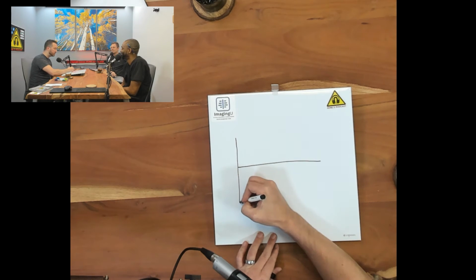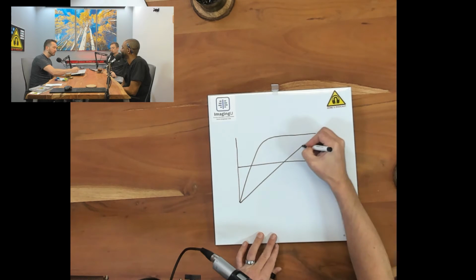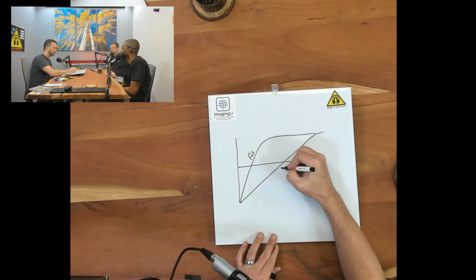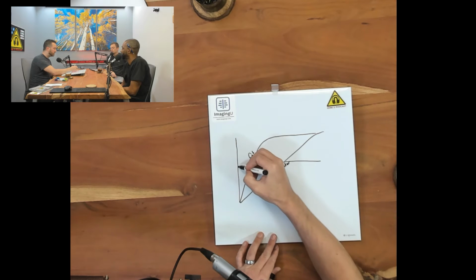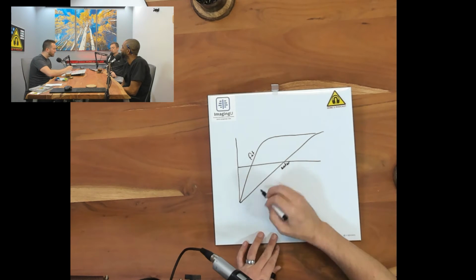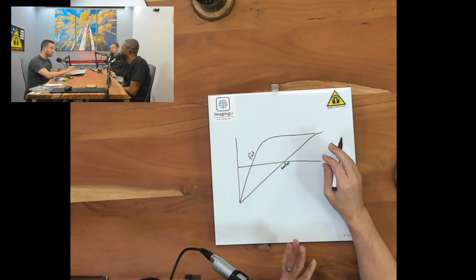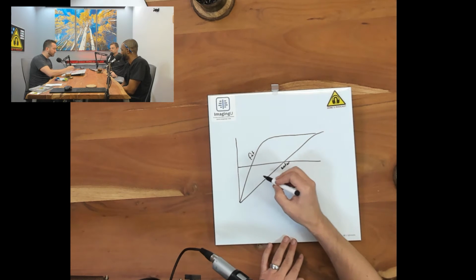So you see these T1 recovery curves. Let's say that's fat, and this is water. I've done a 180-degree inversion pulse. If we did a 90, that's saturation recovery. But if we do a 180, that's going to be inversion recovery. And the whole point of any time we're giving an inversion pulse is to make something dark. Right. So what I didn't really understand is what's happening here.